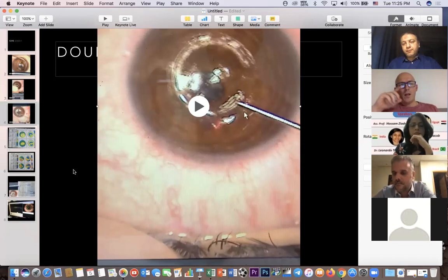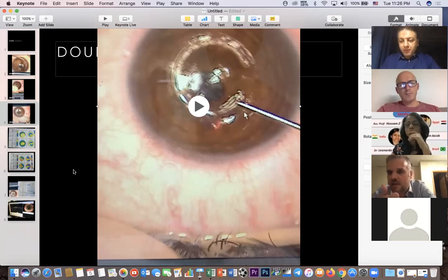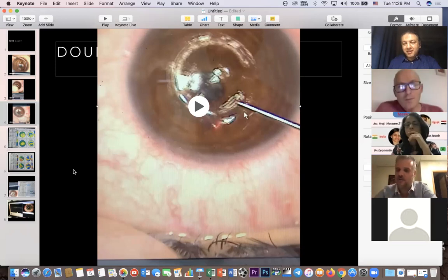Yes, Leonardo? Perfect, Dr. Refai. I think it's exactly the way to go. But besides the scleral lens, or maybe even easier than the scleral lens, is the acuity with the pinhole. Because with the pinhole, you suppress all the aberrations, so with that vision, you can have the potential of vision with the rings. It is something useful to do as well. I call the scleral lens test like a corneal aberrometer, and the pinhole like a total aberrometer. So we should use both of them.